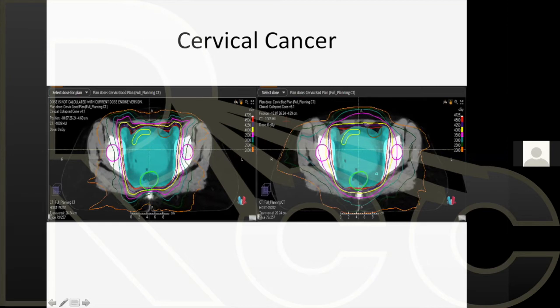Down here, this is actually treating more of the sacrum. What is going to happen? The patient will have a skin breakdown, right? See this? Where this is actually getting off that skin. So the thinnest area, we're off that skin. So we will reduce skin breakdown here, and we will reduce skin reaction here.